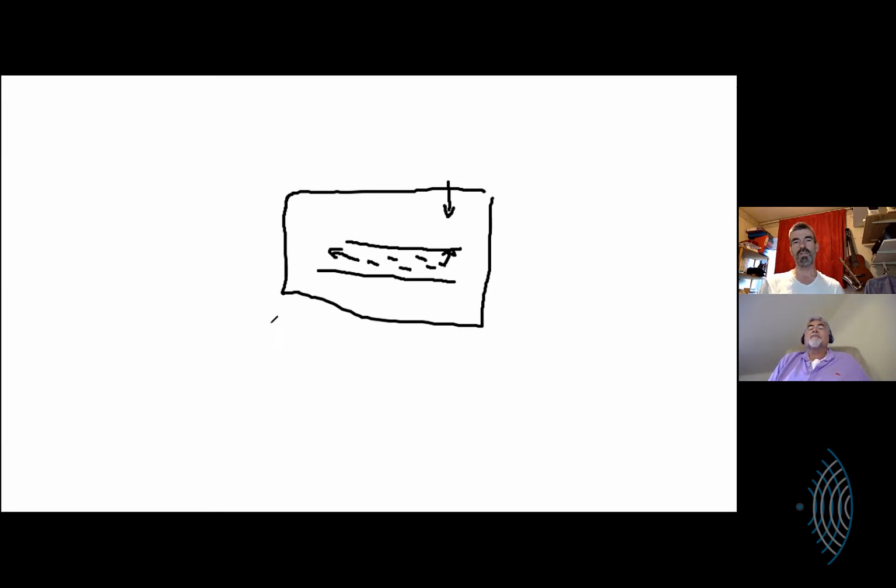However, when you look at low flow in musculoskeletal structures, the actual flow is all in lots of different directions. It's never just parallel to the probe. And so I don't care about whether I see the flow going across the screen. Because for every bit that's going across the screen, there's lots going down.